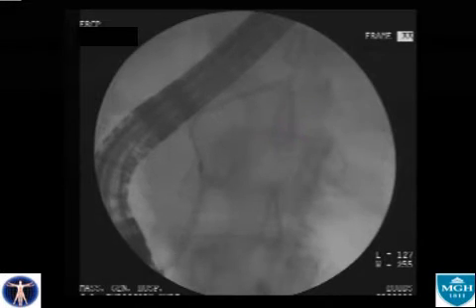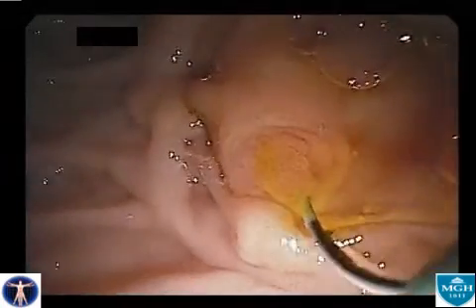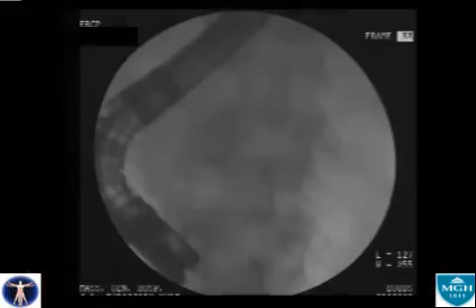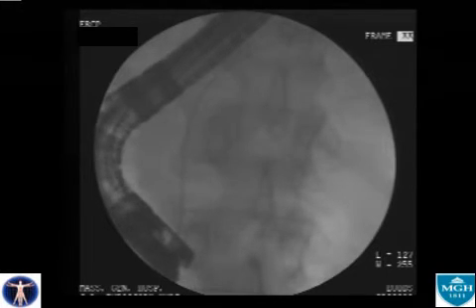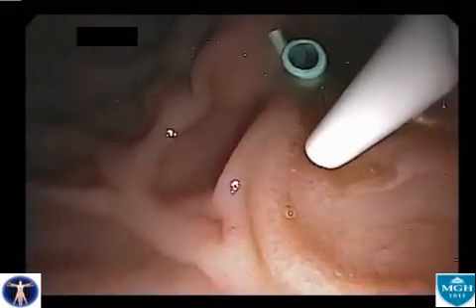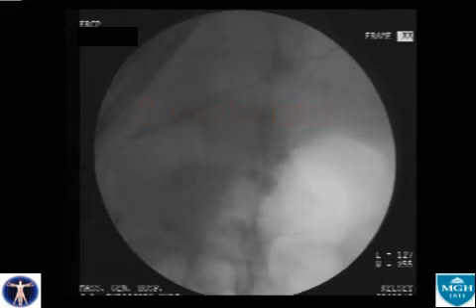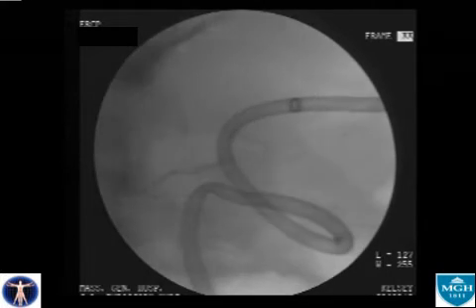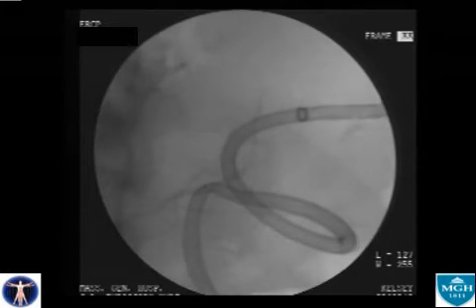A wire is reintroduced into the catheter, and a 5 French 7 cm stent is passed up over the wire. The upstream end of the stent approaches but does not cross the region of the defect. Following stent placement, drainage of pancreatic duct fluid into the surgical drains promptly ceased. The patient returned 2 weeks later to have the stent removed. Reinjection shows no evidence of a persisting leak, and the patient's convalescence continued uneventfully.